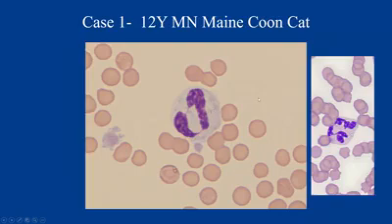And that is one indicator of toxic change. Toxic change is when the bone marrow is responding, most often, to an inflammatory stimulus and ramps up production. When it does that, it starts to release cells with some immature characteristics. Toxic change comprises some of those immature characteristics, with cytoplasmic basophilia being one of them. Why do we care about toxic change? Because it usually means that there's inflammation in our patient.